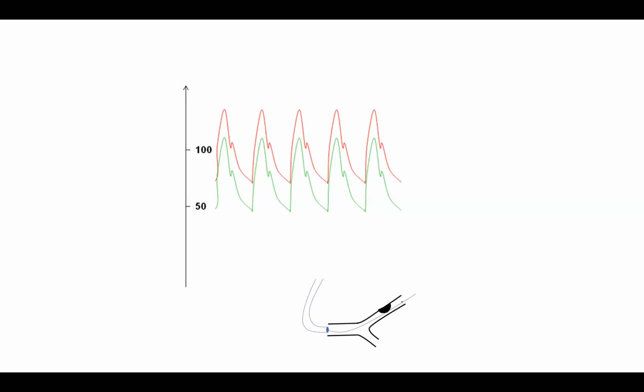Make sure those two pressures are equalized. Most likely in this case, those two pressures are not equalized. You have unequal levels of those two transducers, creating a fake difference in the pressures. This is actually a very common error that happens in up to 20% of FFR measurements.